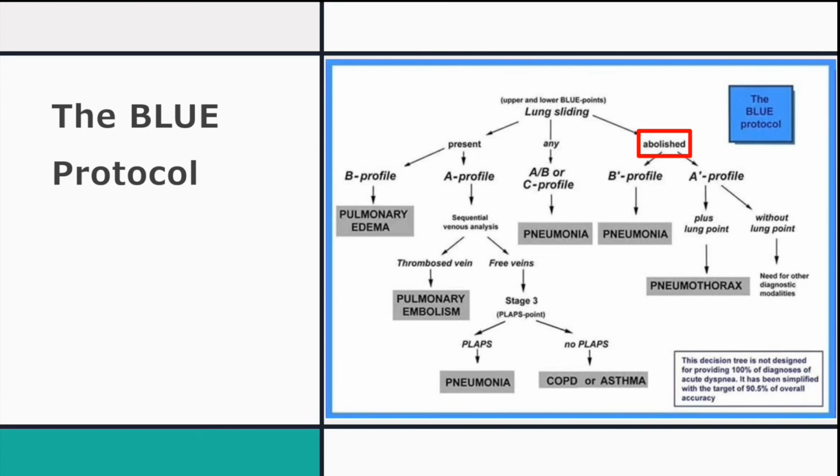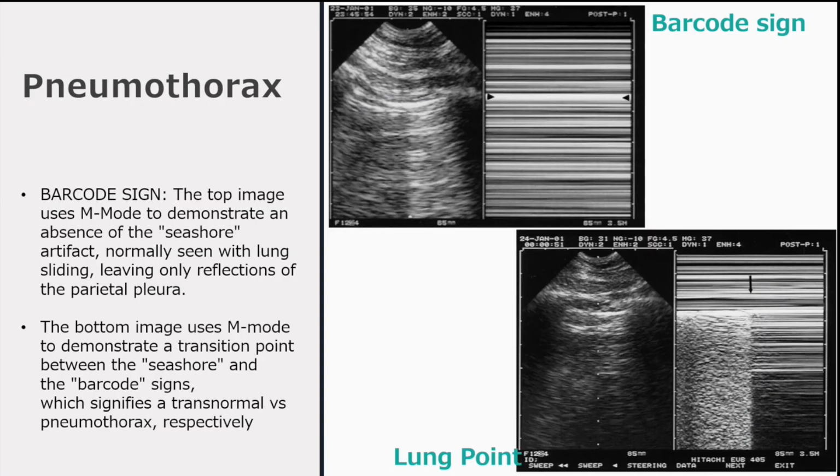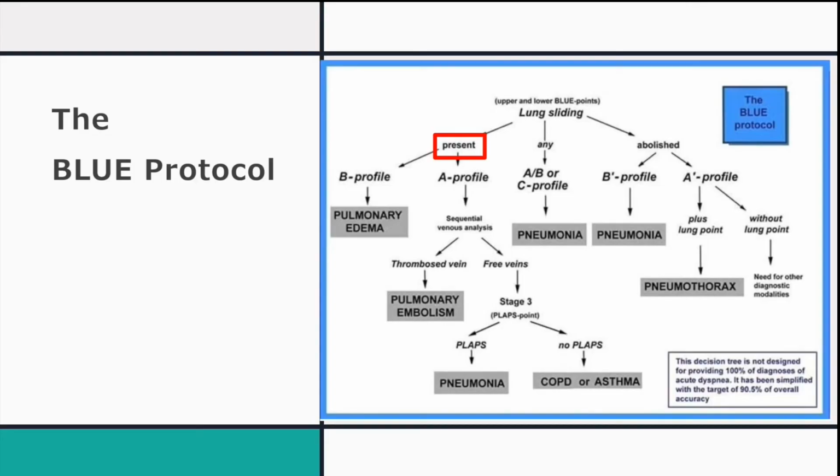Basically, we've looked for lung sliding. There has been no lung sliding, and that's where we are. So, moving on. So pneumothorax, as you might recall, is down one of those lung points. So we'll be looking again at the A profile right there.